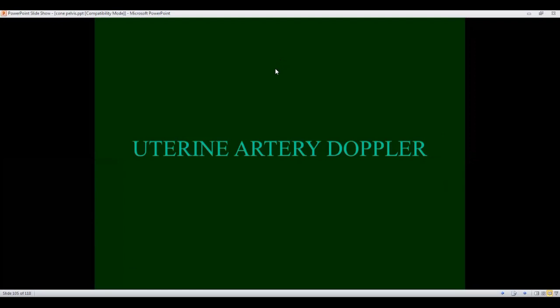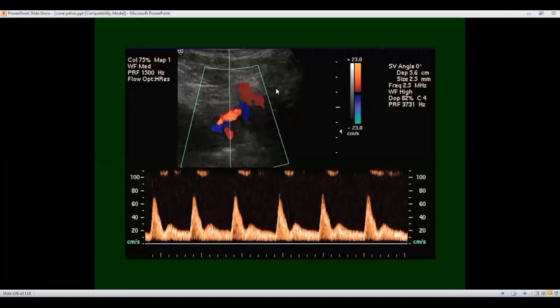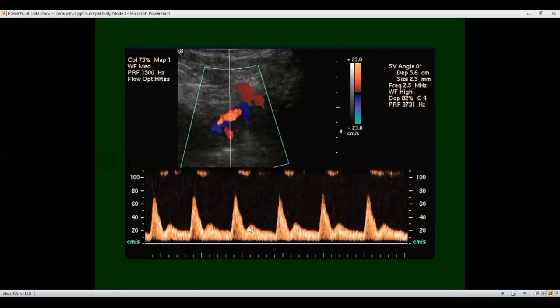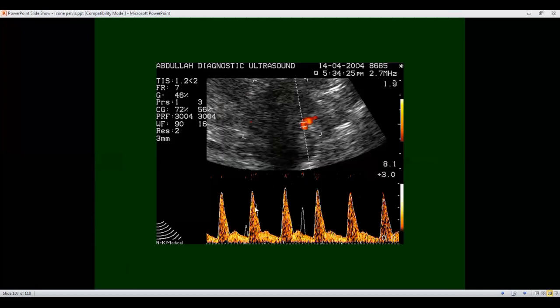Uterine artery Doppler. Normally the uterine artery Doppler is on one side of the baseline - a positive flow as you can see. There is a systolic rise and then there is a fall with a notch here - an early diastolic notch. This is a non-gravid uterus; this is how the phase information of a non-gravid uterus will appear. This notch is seen when the aortic valves close. This is forward flow and then the systolic rise again - uterine artery Doppler with a diastolic notch.